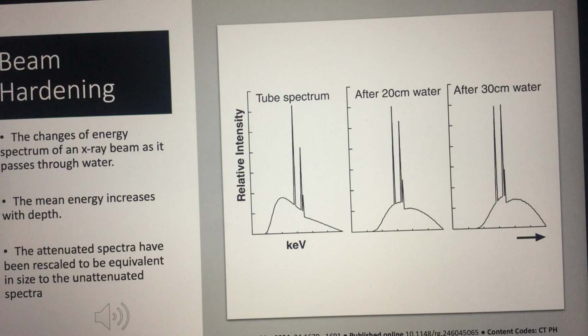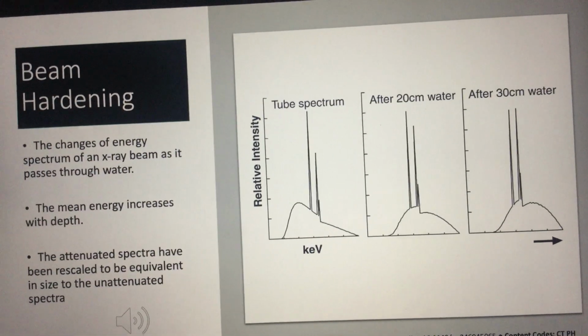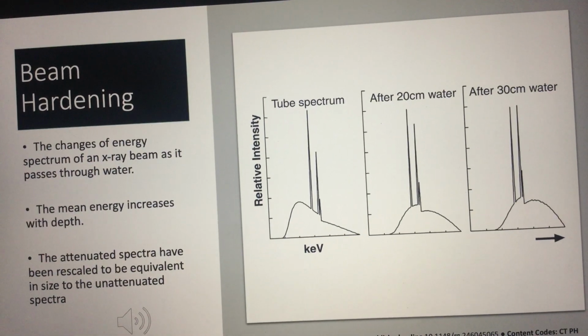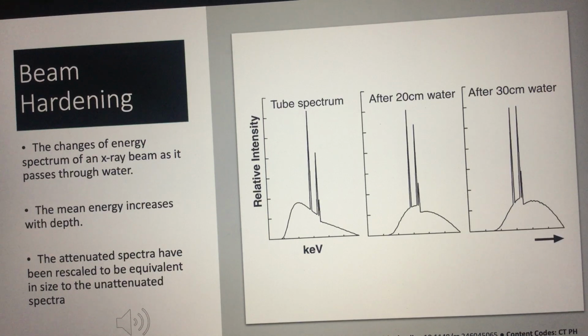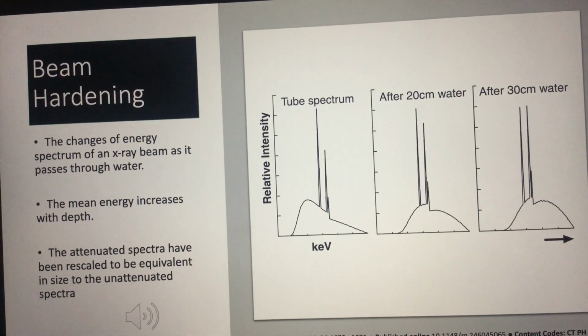That means that the soft X-rays produced by the X-ray tube penetrating the patient will get absorbed on the skin surface and do not contribute to image formation. Instead, they contribute to a higher skin dose. Beam hardening is required to remove soft X-rays and harden the beam so that it has sufficient energy to penetrate the patient.